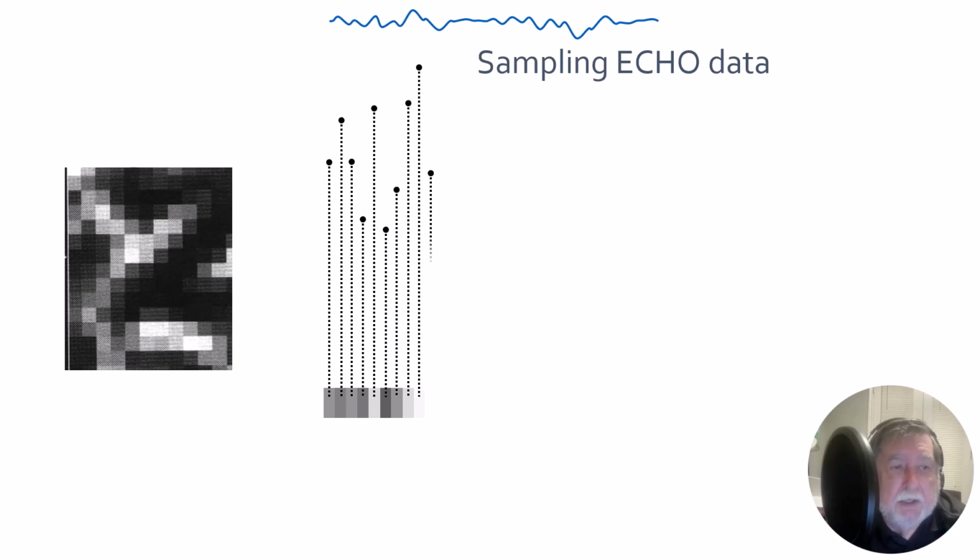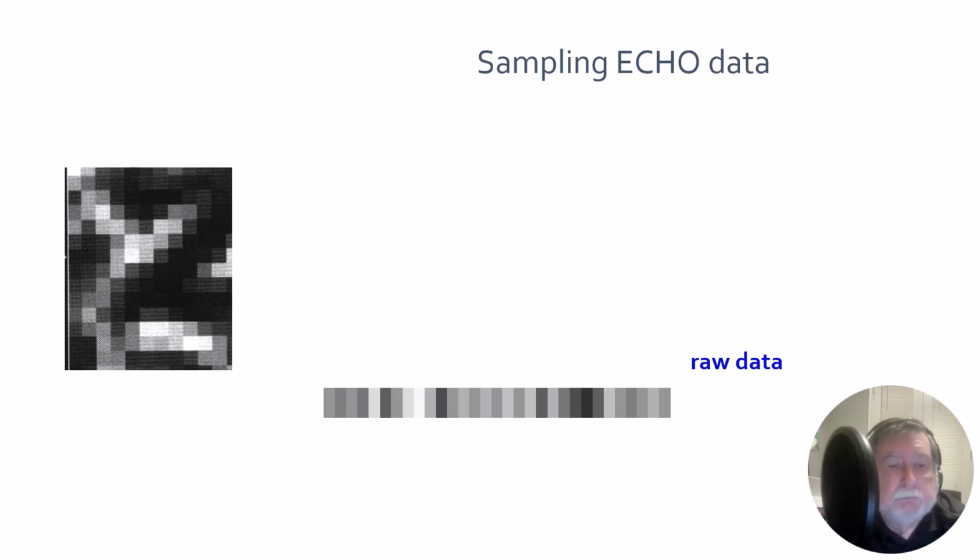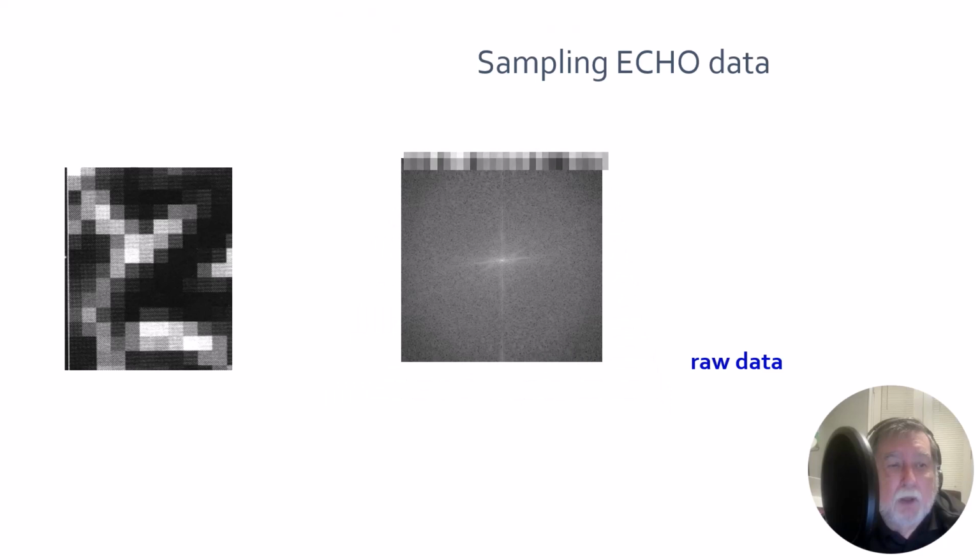Notice that at each point along the wavelength we are assigning a sample or number that is now corresponding to a shade of gray. This is raw data. The raw data is stored in the computer in different lines in a thing called K-space, which is the storage space.